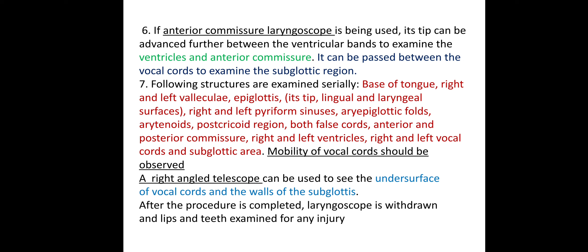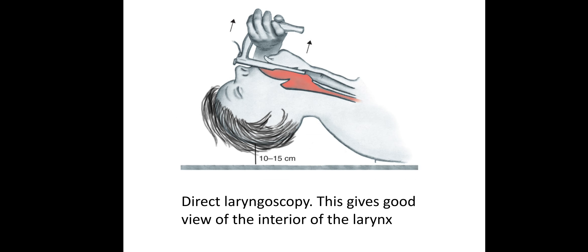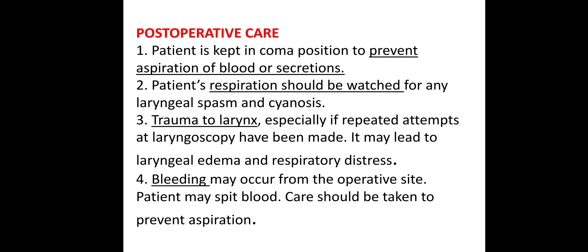After the procedure is completed, the laryngoscope is withdrawn and the lips and teeth are examined for any injury. Post-operative care: the patient is kept in the coma position to prevent aspiration of blood or secretions. The patient's respiration should be watched for any laryngeal spasm or stridor.